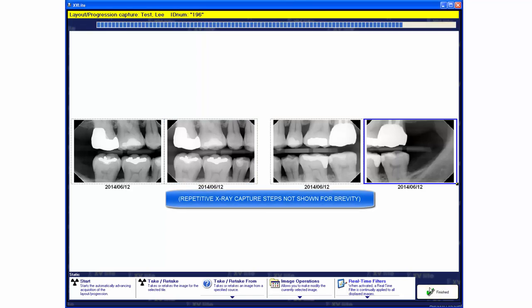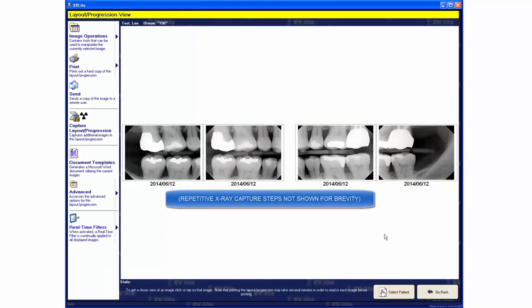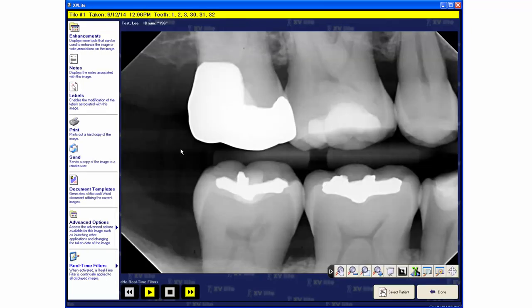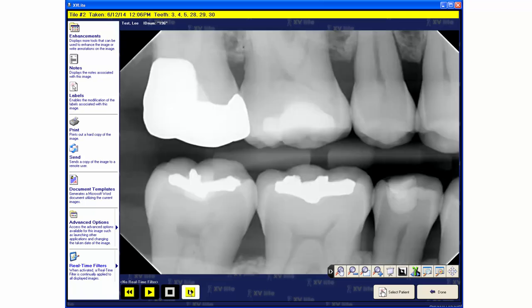After the four ByteWing series is captured, the images are saved by X-VLite on the patient record in the database. The operator can then magnify each image and perform other enhancements.